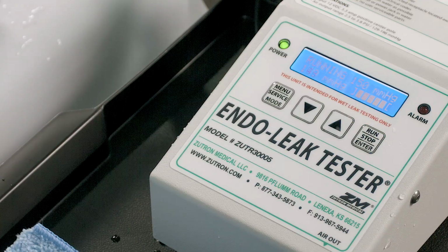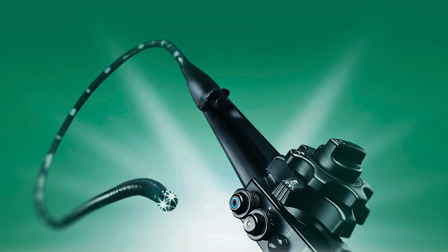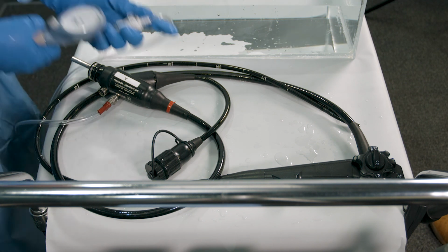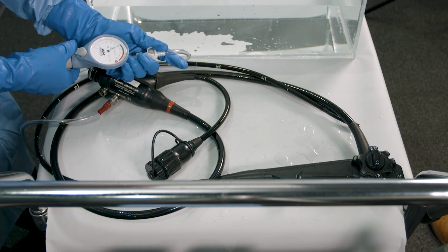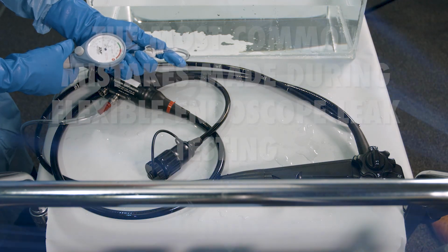You may need to apply external tape or take extra care to protect a large area that's cut to reduce air loss and avoid serious additional fluid damage. Utilizing a handheld leak tester instead of electric makes you, the human pump, responsible for keeping the pressure within the safety zone during all of the subsequent cleaning steps. This may even take 2 people, one to pump and one to clean.